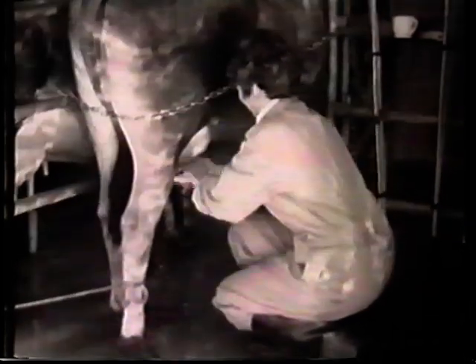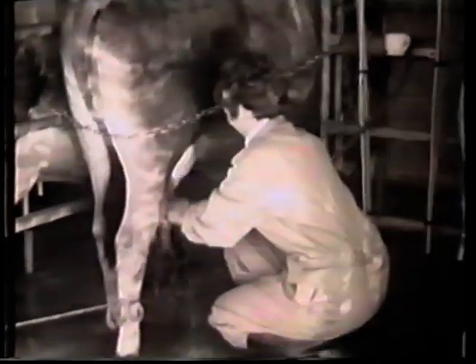Animal studies underline the value of human milk for human infants, but a mother cannot always feed her baby as nature intended. When a baby fails to suckle properly, the breasts lack stimulation. The problem then is one of keeping the mother's milk still flowing. Dairy techniques are designed for just that purpose. The vacuum cups pulsate, the milk flows, and the cow feels no discomfort. Indeed, every care is taken to make the process a pleasant one for the milk producer.